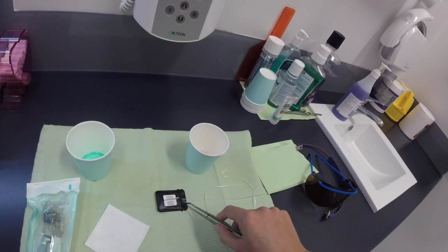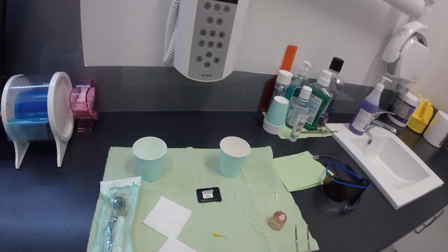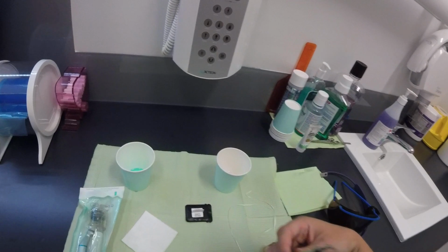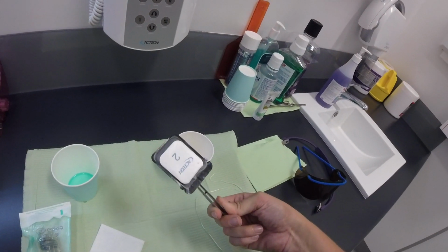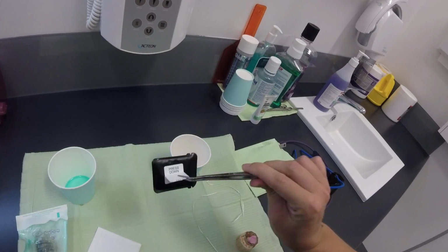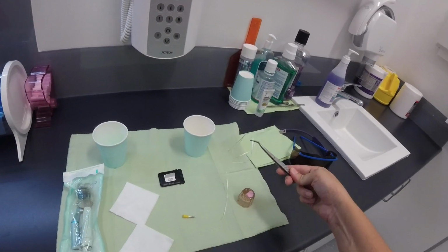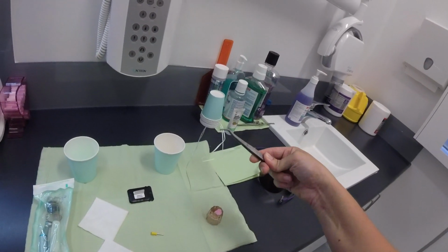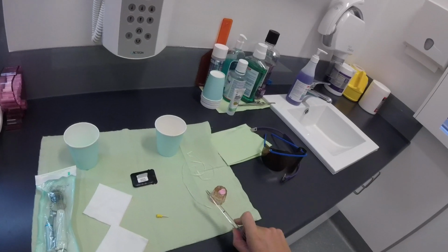We use the digital x-ray system in this practice. Sometimes you do a manual process. It's old-fashioned, but it still works really well. But yes, this one's quite easy for us nurses. We can just take them out and process. So that's an x-ray. Over here, we've got some floss. Obviously, the dentist uses that to floss in between the patient's teeth after the clean to make sure we've got all the debris out.